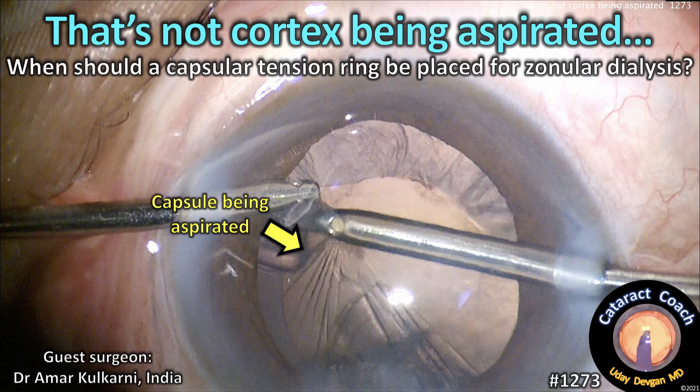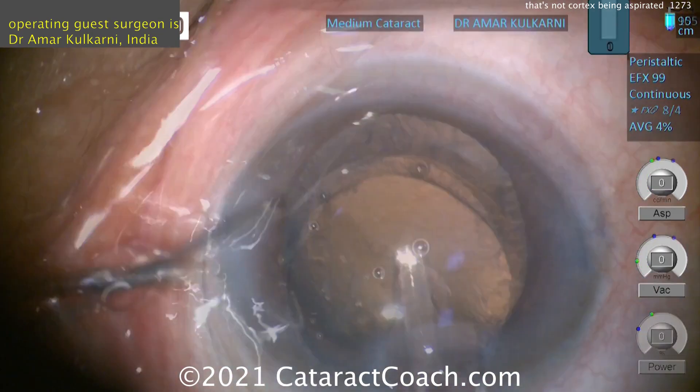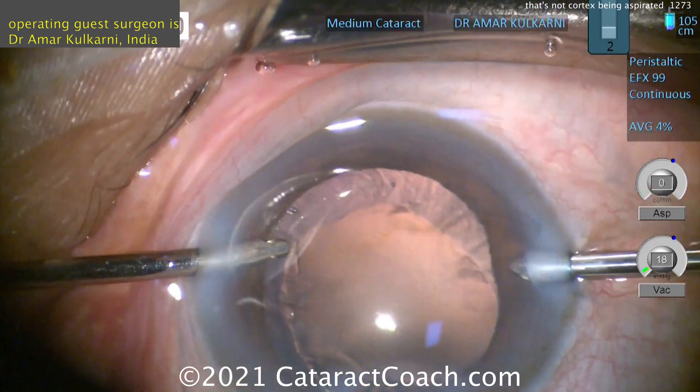CataractCoach.com. When should a capsule tension ring be placed for zonular dialysis? Our guest surgeon here is Dr. Amar Kulkarni from India.